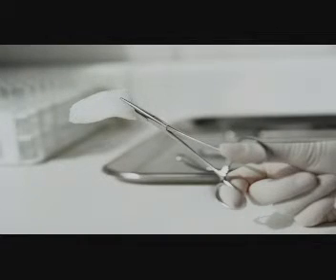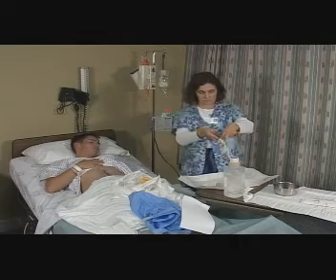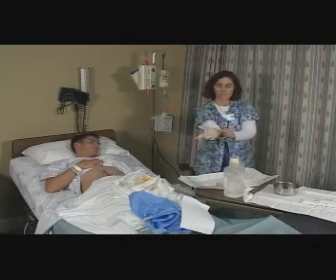Prior to cleaning any wound and changing the dressing, you will check the provider's orders. You'll follow your institution's policy for the specific procedure. You'll also be sure to plan the dressing change to coincide with the peak effects of the pain medication the client is receiving. Infection control is a high priority with a surgical wound. Thus, it is essential to maintain surgical asepsis as you cleanse a surgical wound and change the dressing.